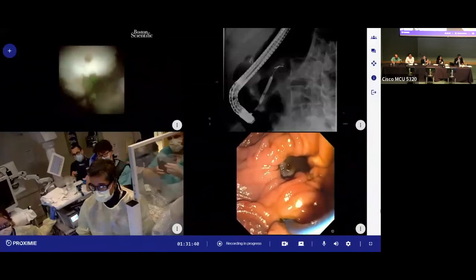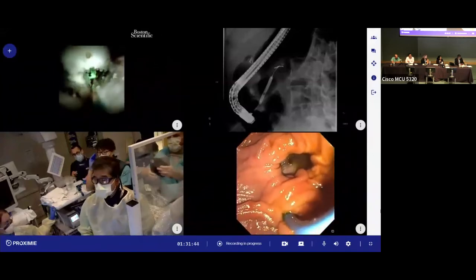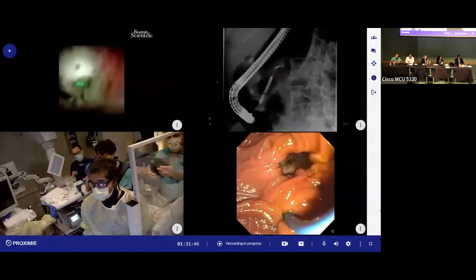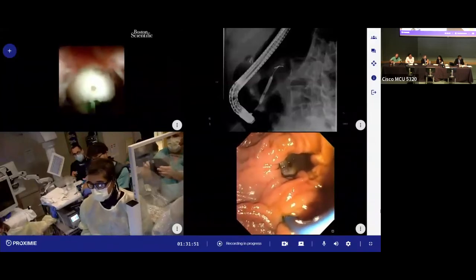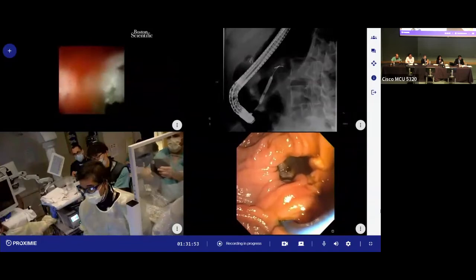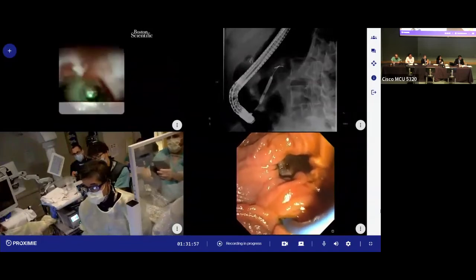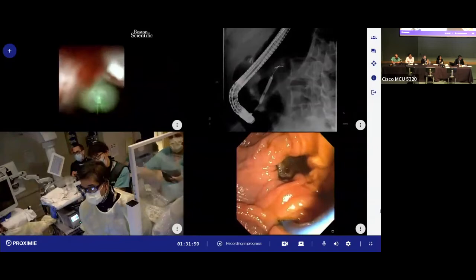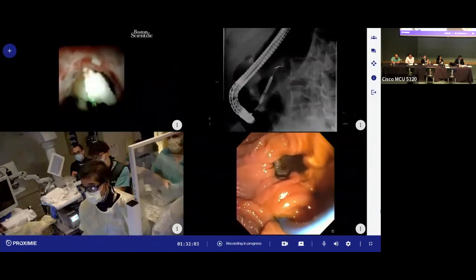Sam, you cut out. We can't hear you. Sam, can you speak up? They can't hear you. EHL and laser lithotripsy for pancreatoscopy lithotripsy. We're basically allowing 4 sessions for each treatment arm before we consider it a failure. And we're allowing crossover as well. But it'll be good. In Europe and Asia, very good.